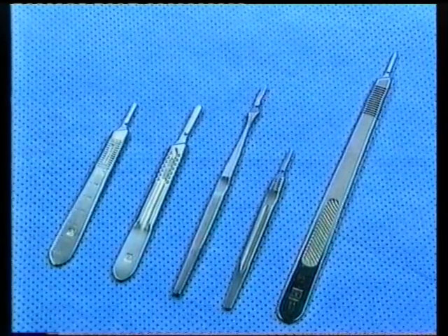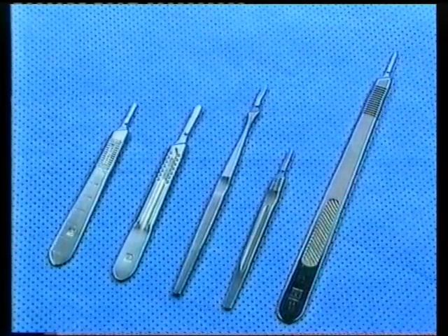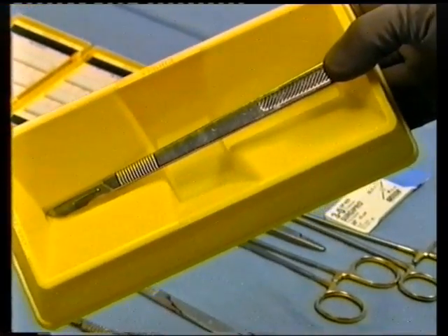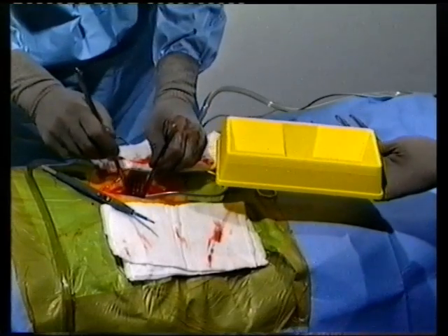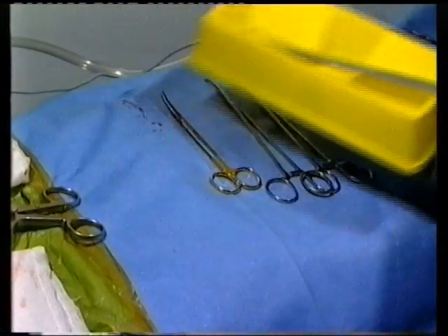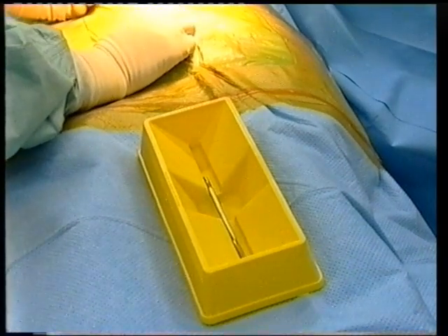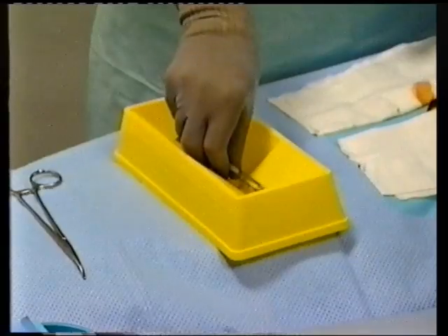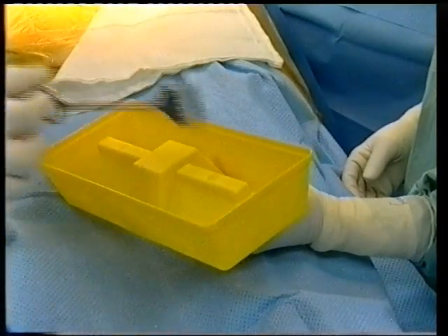Number 3 and number 4 extra-long scalpel handles do not fit full length into the ScrubSafe device, but can be passed more safely than by hand-passing. Simply position the blade portion into the bottom recess and place your thumb over the distal end of the handle to stabilize its position. The scalpel recess can also be used for transferring other sharps such as used drain trocars and K-wires. This recess is also useful for handing assistants skin and tissue retractors such as skin hooks and cat's paws, and for larger claw-type retractors, the other side of the ScrubSafe device can be used to safely shield the sharp claws during transfer.